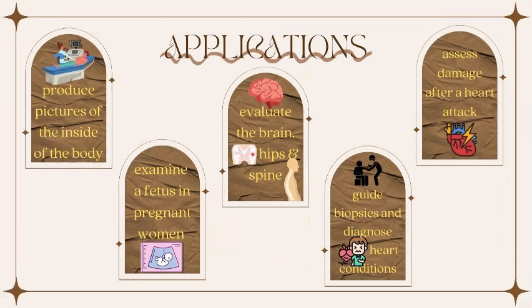The ultrasound machine has many applications in life, such as producing pictures of the inside of the body, examining a fetus in pregnant women, evaluating the brain, hips, and spine, guiding biopsies, and diagnosing heart conditions, and last but not least, it assesses damage after a heart attack.